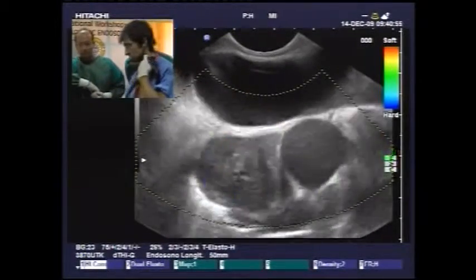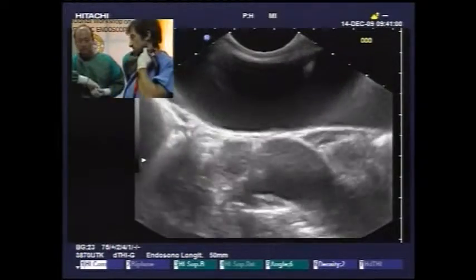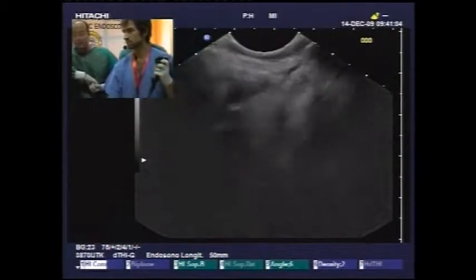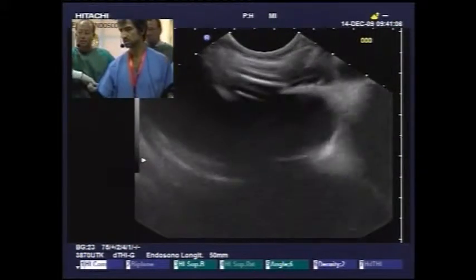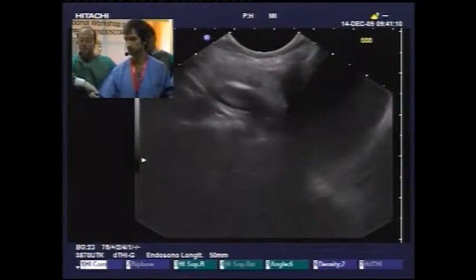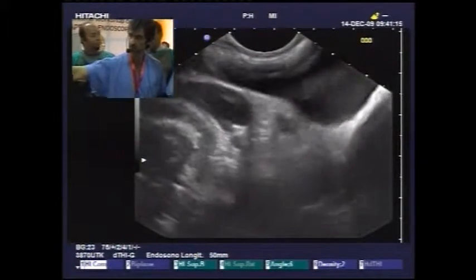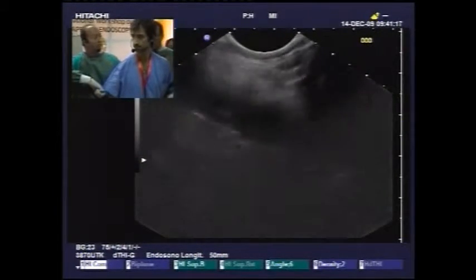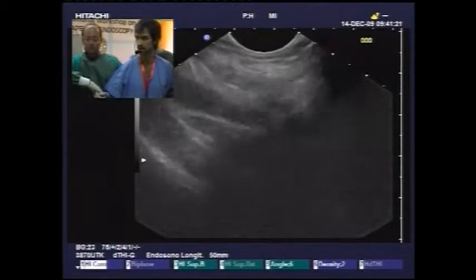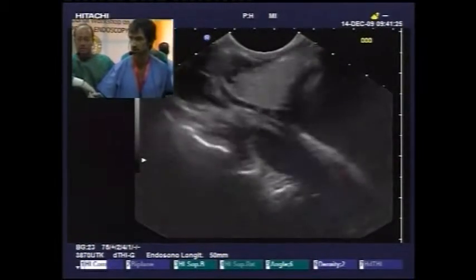Pull on the wire a little. It's okay, it's fluoroscopy. You're not able to get it? No, just wait, stop. We'll have to get it in a little deeper now, so I'm going to get my scope out a little more. Yeah, now we are in a better position. You have to keep pulling a little as you go. The angle.